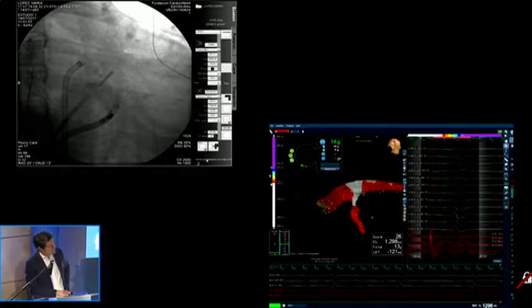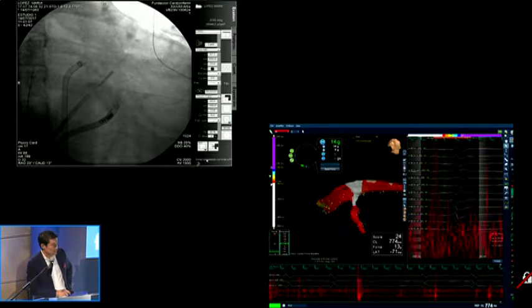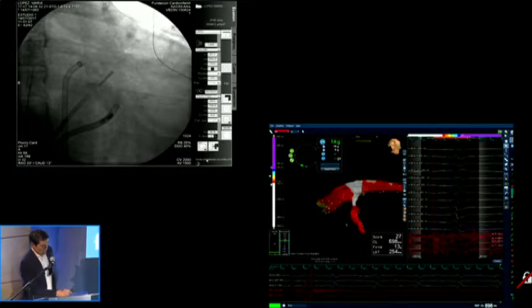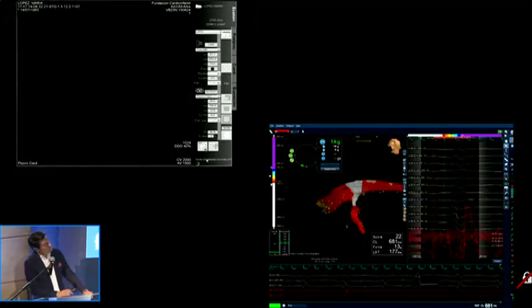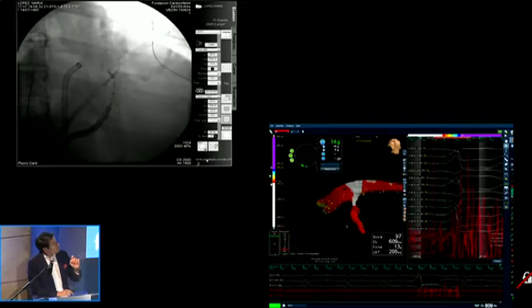And obviously, the next step will be what you said, to do an endoablation. But the distance on the map and on the ice is less than 1.5 centimeters. So when you have a larger distance, in particular in this area of the heart, which is the most basal area where there's a lot of muscle tissue, you need to apply large lesions. And I think that the key here to prevent complications is to try and predict based on the distance between one catheter and the other.